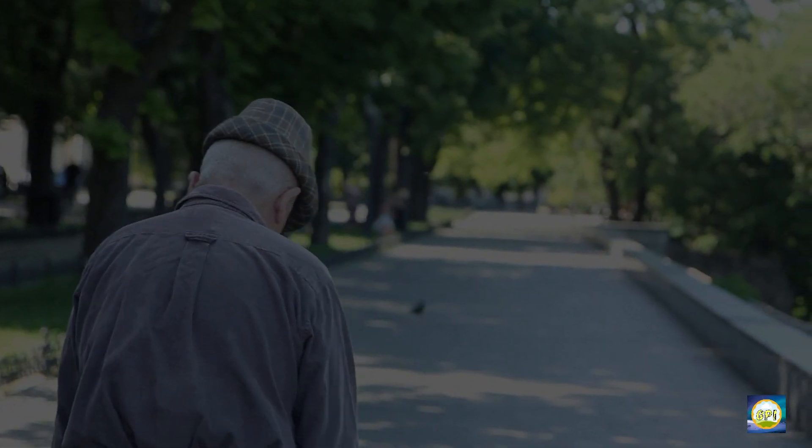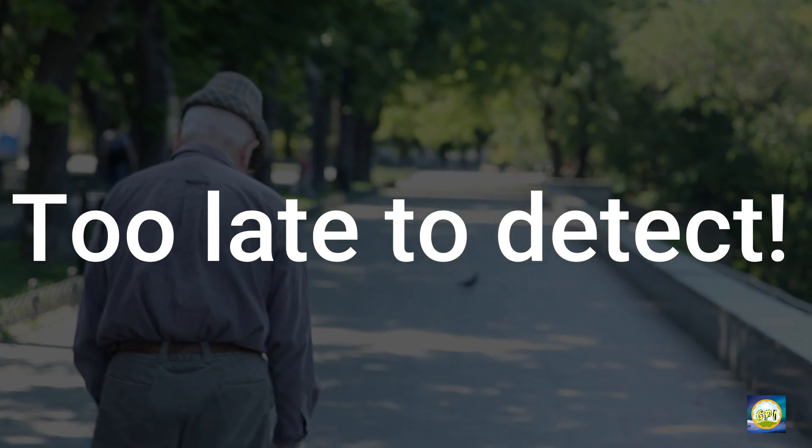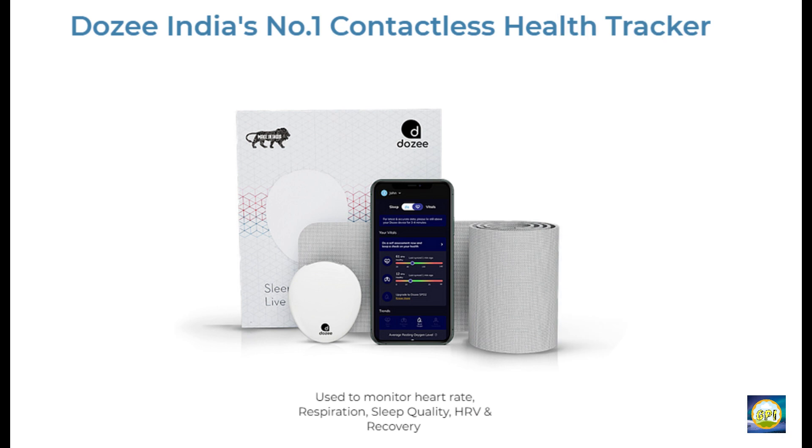Many issues of our body go untreated just because we come to know about them very late, or in some cases we can't even track them down. That's where Dozee comes in. With the help of this device you can constantly monitor your body — like heart rate, breathing pattern, sleep pattern, and more body parameters.